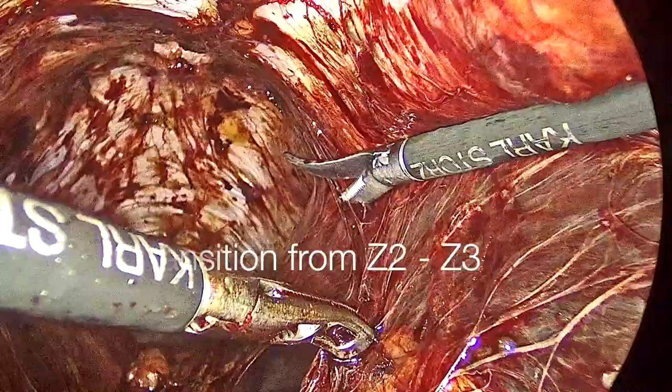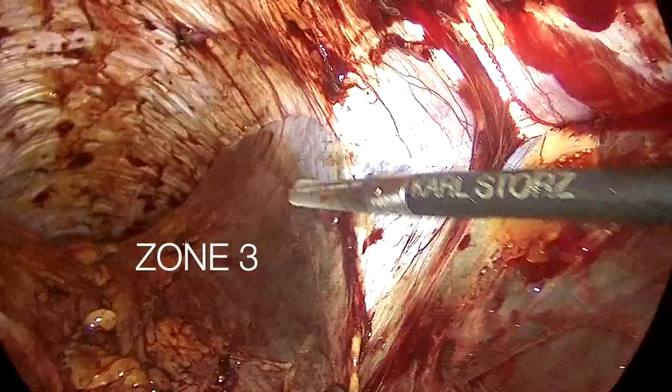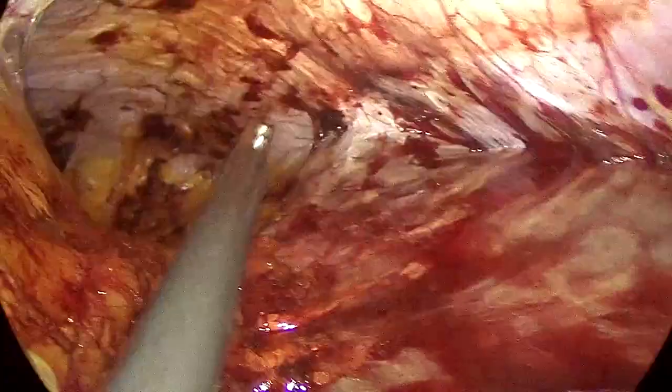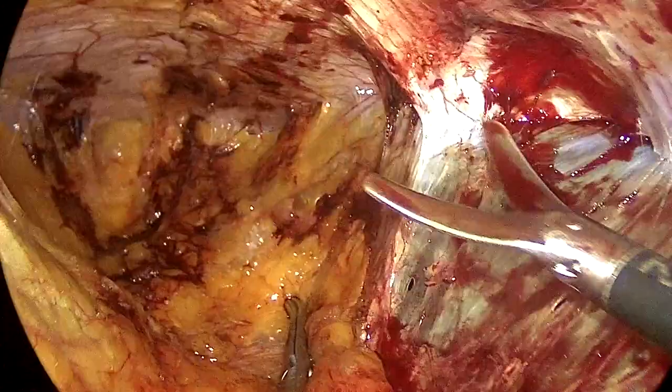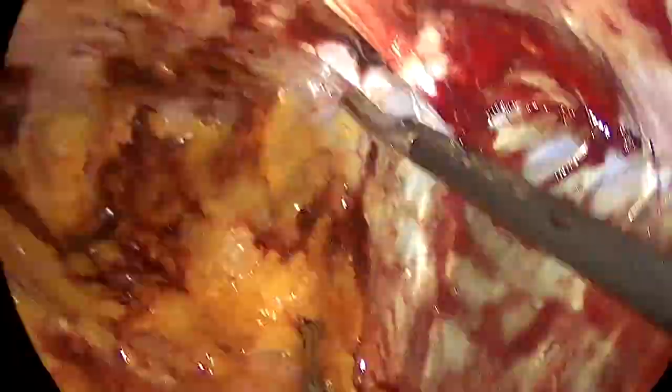Now, this is the hard part of the procedure: making the transition from zone 2 to zone 3. By doing gentle pressing, we always find these vertical fascial attachments from the peritoneum to the posterior rectus sheath or the transversalis fascia.